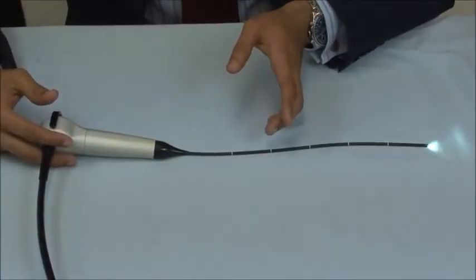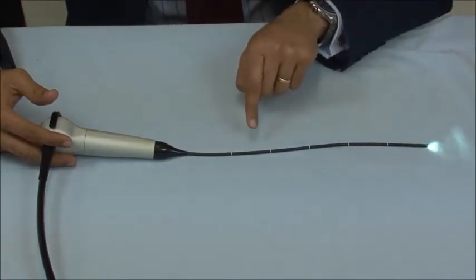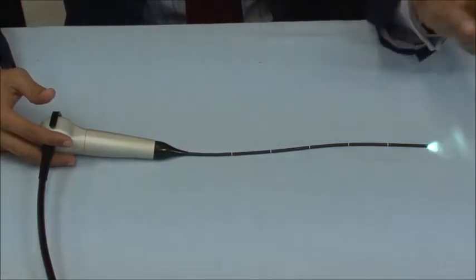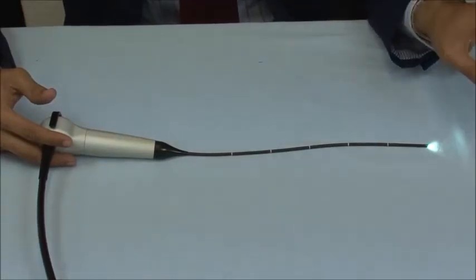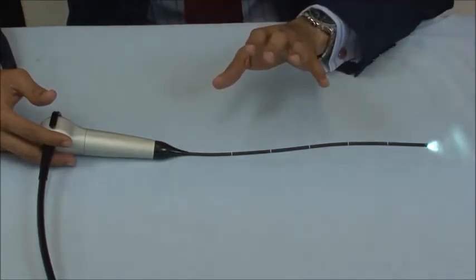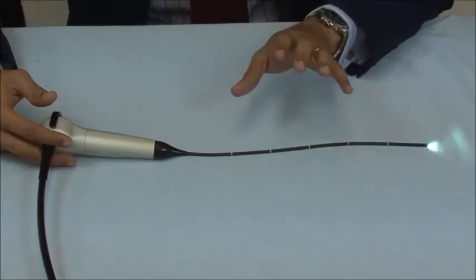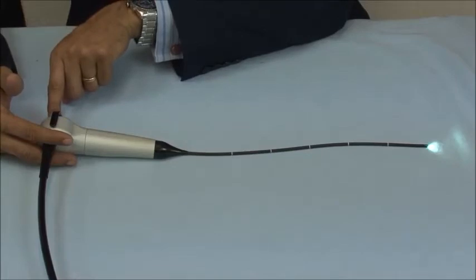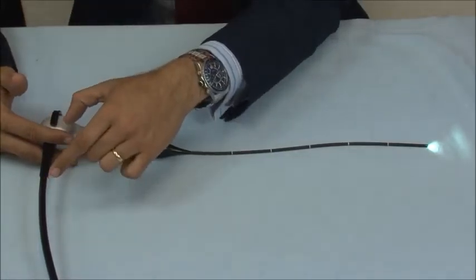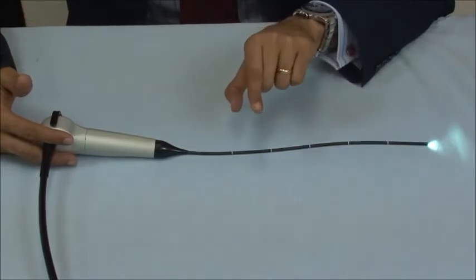This is a flexible nasal endoscope, and there are very many different types of this. This is a state-of-the-art chip-tip scope, which is a cable connected to a screen where not only do you see the images on the screen, but everything can be recorded. There are much simpler versions of this where you still get an excellent view of everything you want to see, but you can have an eyepiece attached over here on the side, and you can have a portable light source. So you don't need any cables or any other equipment apart from just the flexible nasal endoscope.